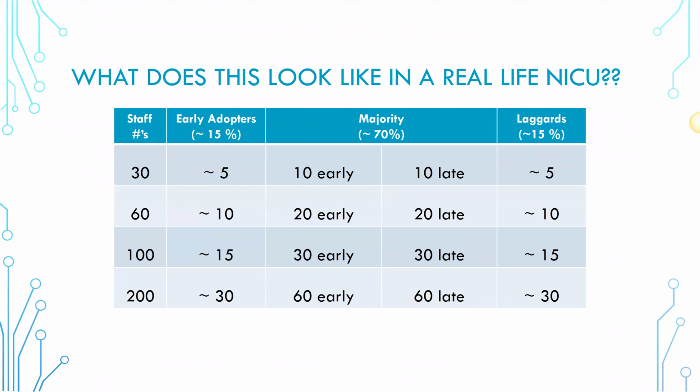For things on the device that you might want to consider, definitely anytime medications are given, that could affect the background pattern or seizures. Anytime we see clinical observations of seizures. Many of our baby seizures are subclinical, so we don't always see them, but if there's a clinical correlate, that's really helpful to note.